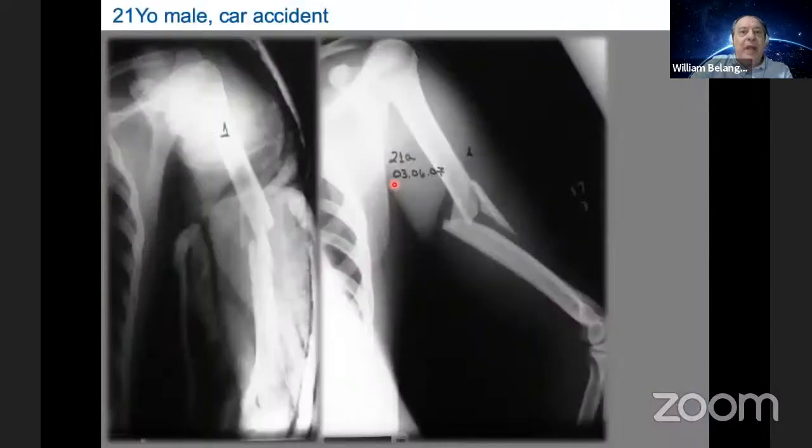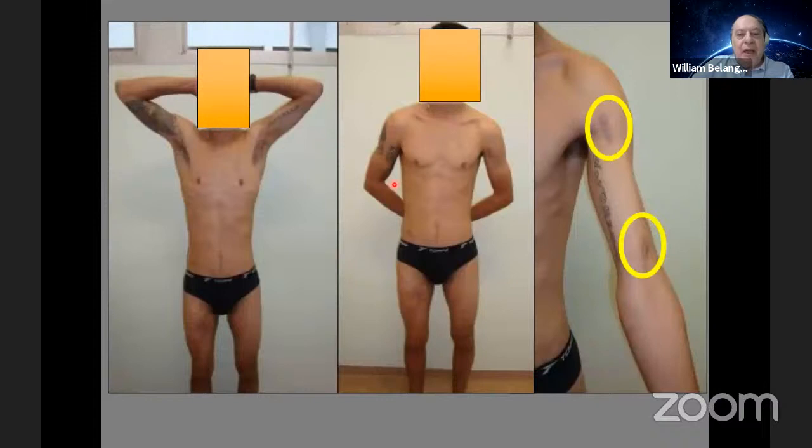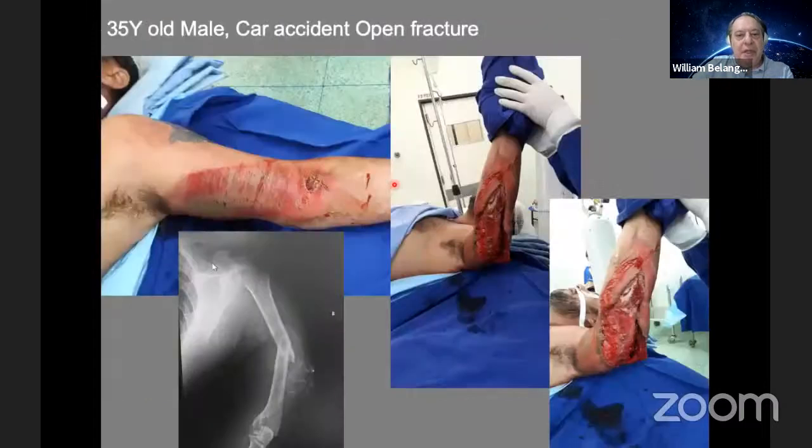Okay, let's see some cases. This is a middle diaphyseal fracture with a butterfly fragment. This is a very easy fracture to treat by this technique. It's important in this technique, I'd like to stress the screw inclination in the proximal fragment to gain better fixation, okay? This is the clinical evolution of the patient.